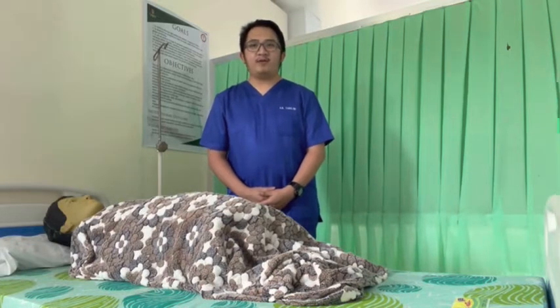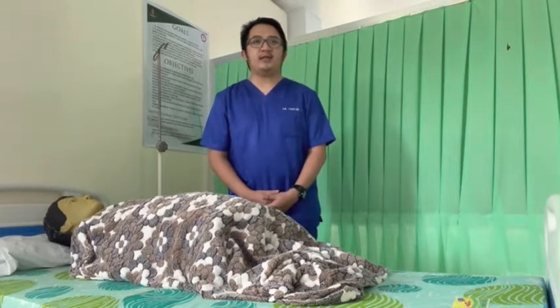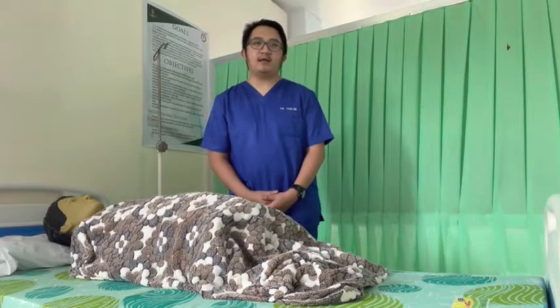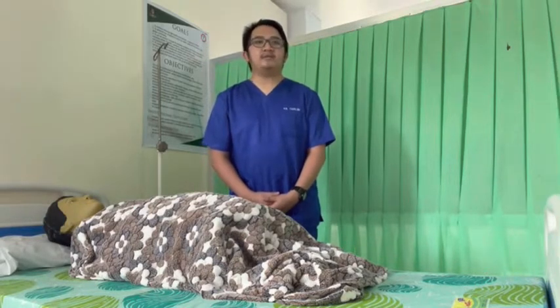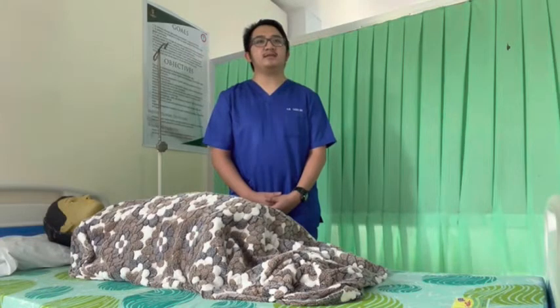I'll be performing a lumbar puncture. A lumbar puncture is inserting a spinal needle into the subarachnoid space in the spinal cord to detect if there is blood in the CSF, to administer intrathecal medication, and to provide anesthesia.